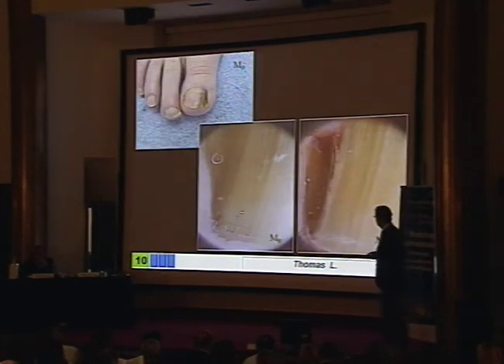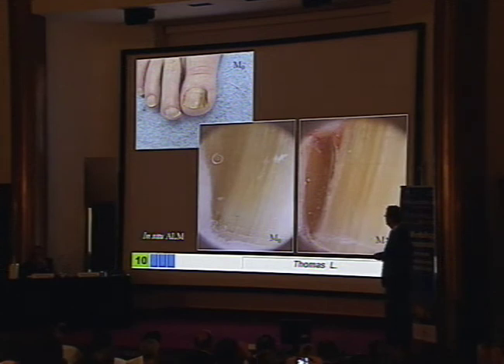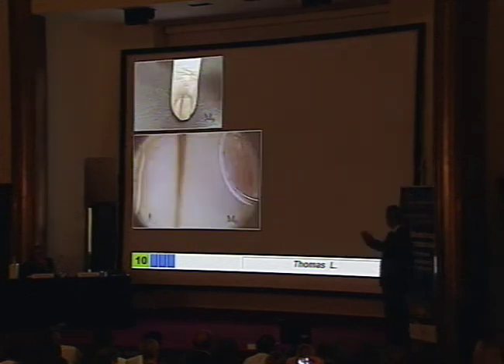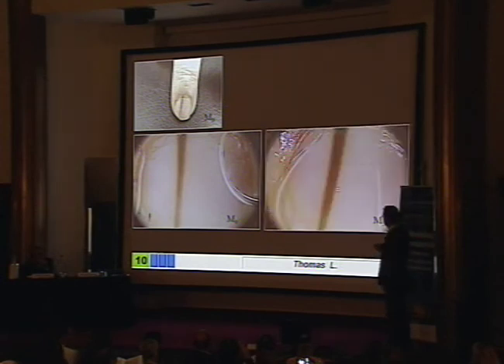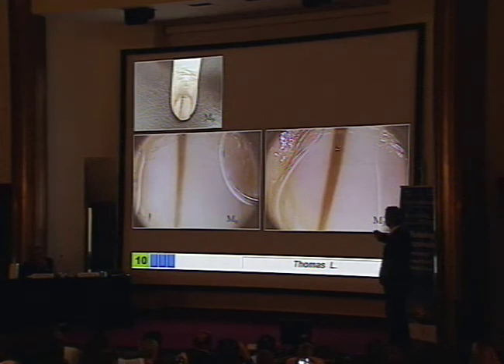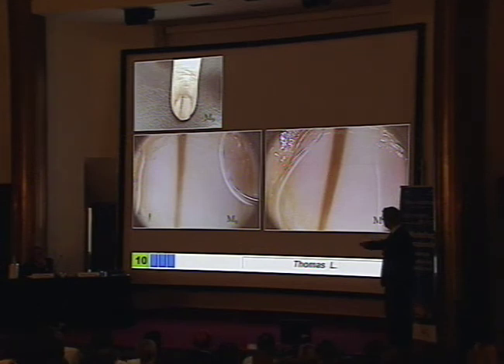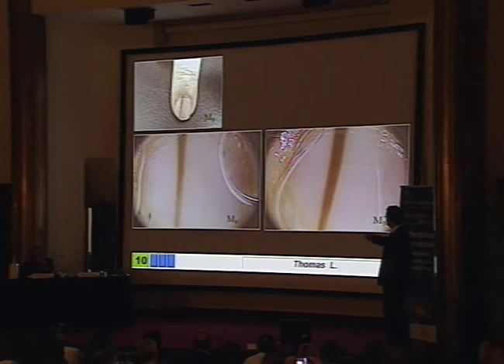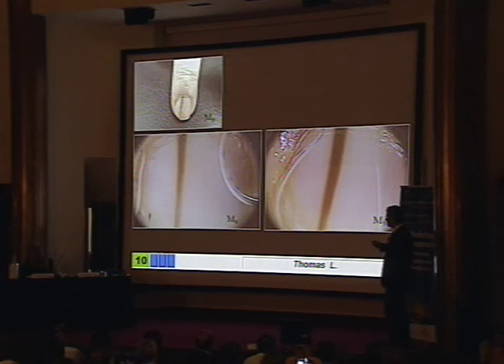Another case changed after two years. There is also a strategy with early and late comparison — a patient seen after three months showed a dramatic increase in the size of the band, with the same scale. The aspect was benign with a regular line pattern, but since it enlarged dramatically within only three months, a biopsy was taken, and this was in situ melanoma.